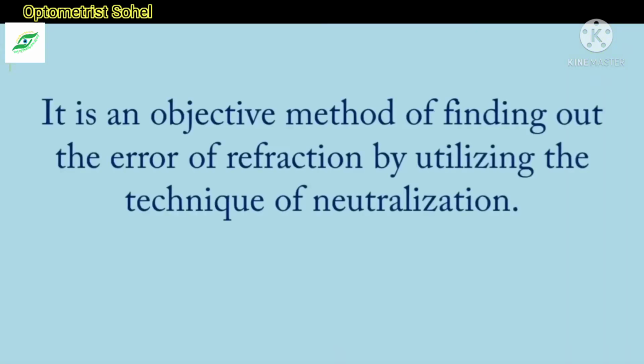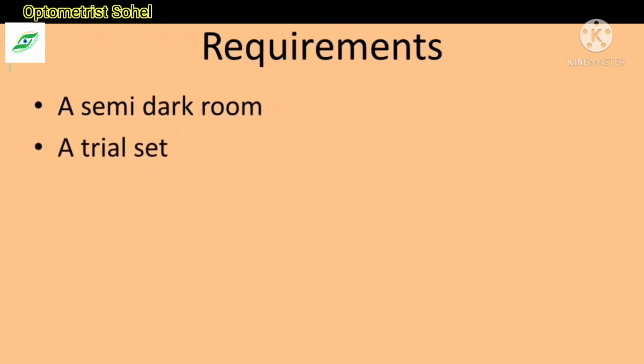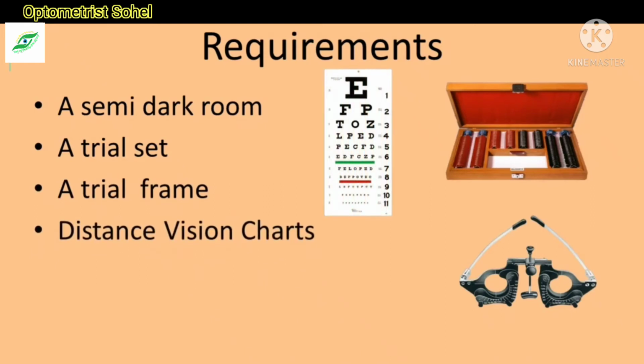It is an objective method of finding out the error of refraction by utilizing the technique of neutralization. Requirements: a semi-dark room, a trial set, a trial frame, distance vision charts, and retinoscope.